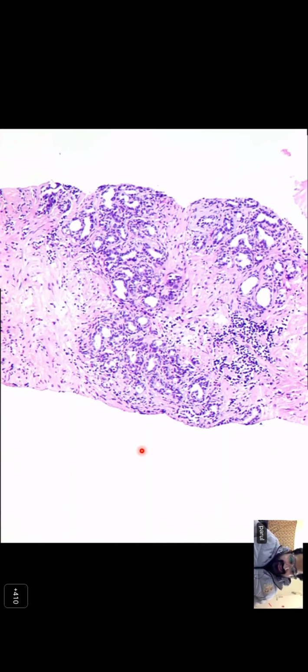Poonam, Himali, Parul, Jayashree, anybody is free to pitch in. Please don't wait for my prompt. So, in this true-cut biopsy of prostate, we can see that the majority of glands are regular. They are well formed, majority. But you tell me first thing, Parul, are they large glands, or do they look normal or not? We had a class day before yesterday.